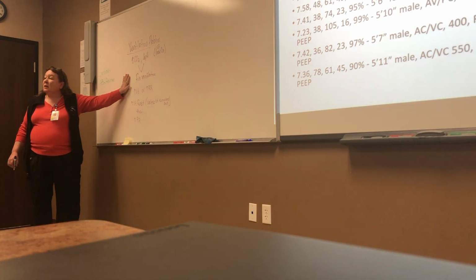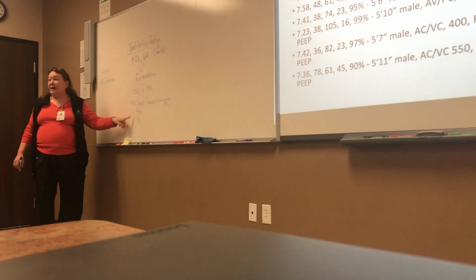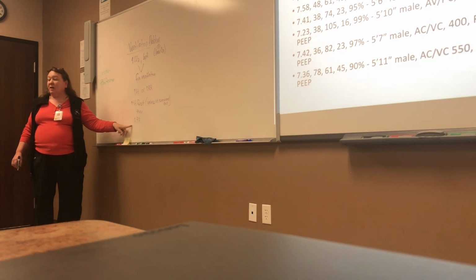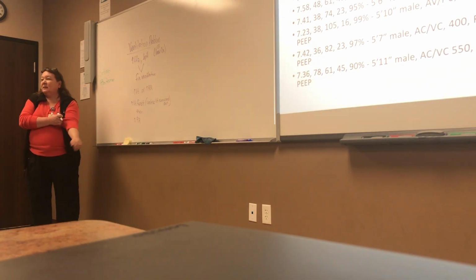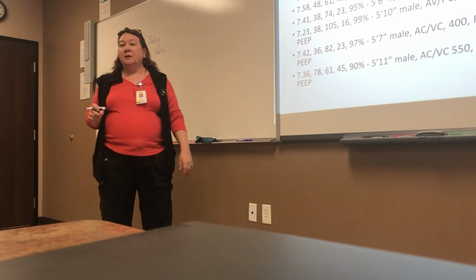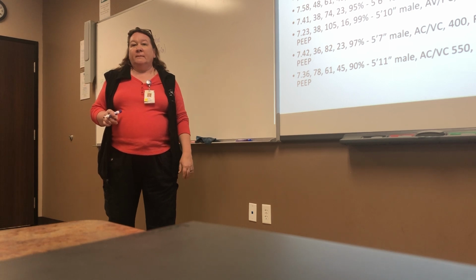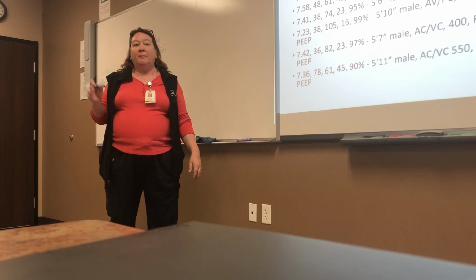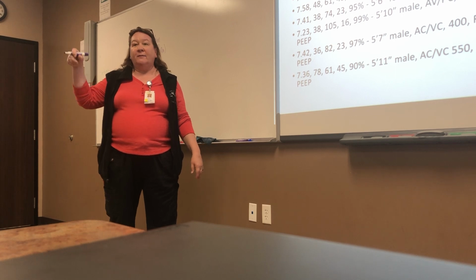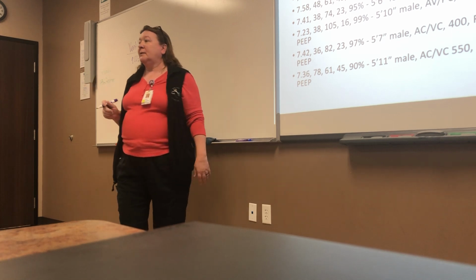You said for the rate, we don't want to go more than 14, okay? No, that was a starting rate. If your patient's at 14, their tidal volume's maxed and your CO2 is high, you'll go up. That's how you end up with patients with rates of 20, 25, 30, because there are times when it's needed. So 10 to 14 was starting, because you're not going to start that high. For tidal volume, if it's 50 before the max, would you change it? I would say if you're within 25 of the max, I wouldn't change it. Just to give you a ballpark, but some of this stuff is not black and white.